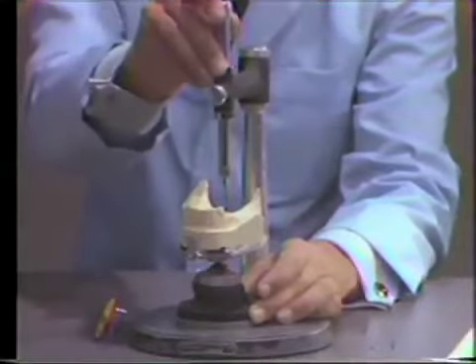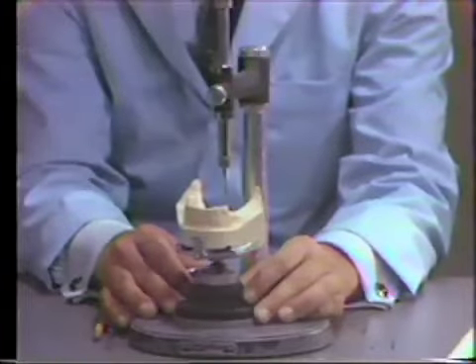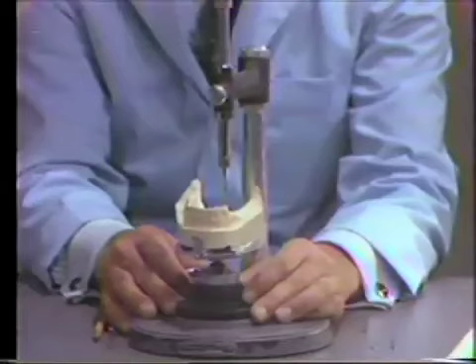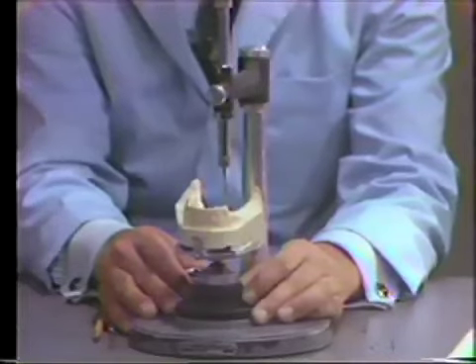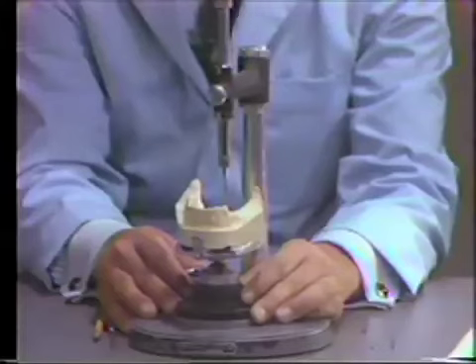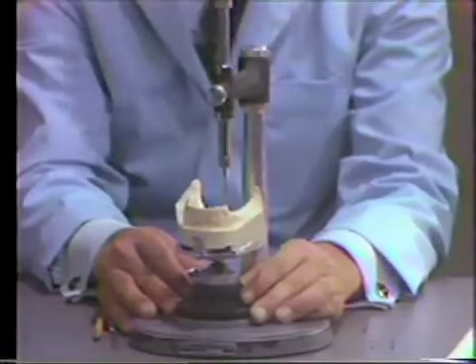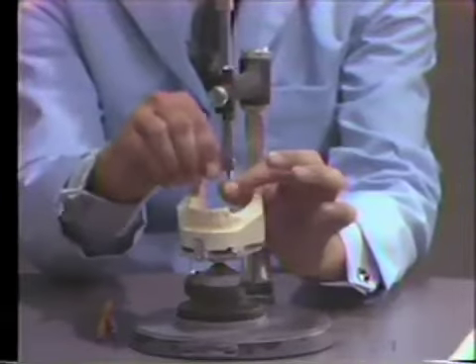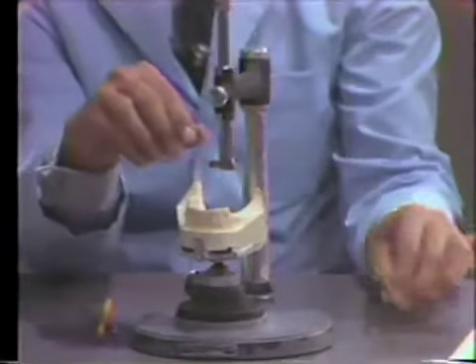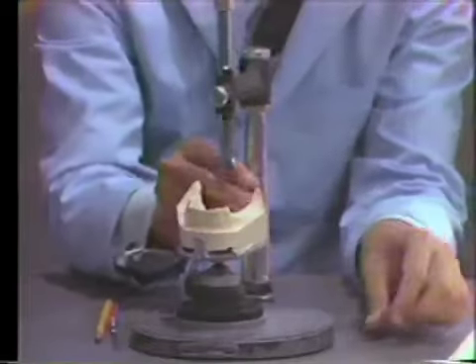So let's go. One other thing that we will do while we have the cast in this position is to mark the heights of contour on the teeth and the ridge to show where the framework will have to be, or where the cast will have to be blocked out prior to making a framework, or where we will have to change certain heights of contour. To do this, we use a carbon marker.